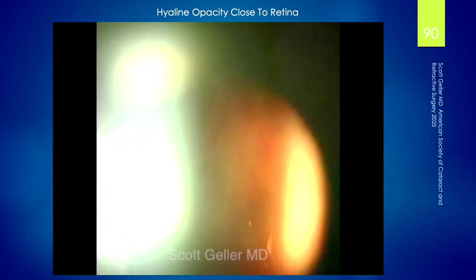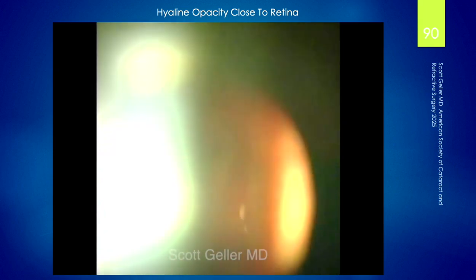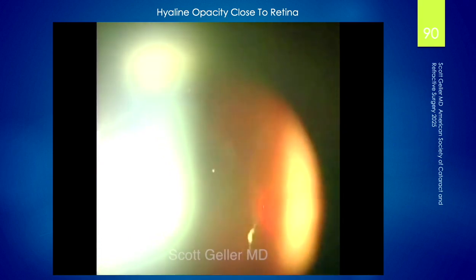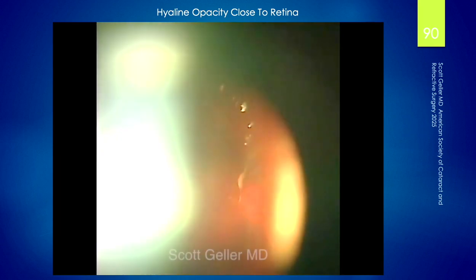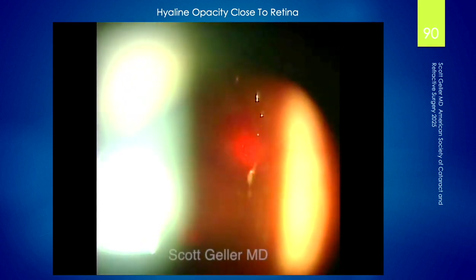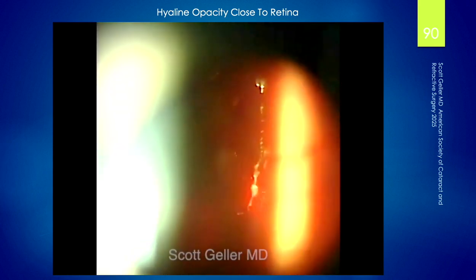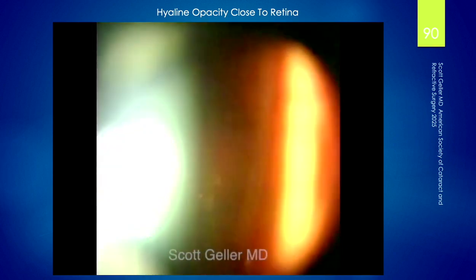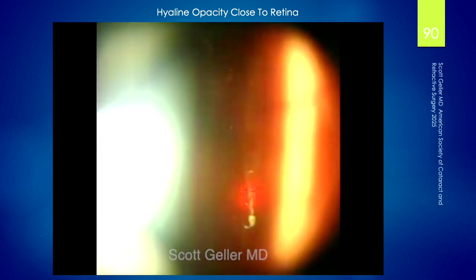Sometimes with an early PVD or an incomplete PVD, these things occur. Sometimes with a complete PVD, it occurs. So just be patient. Do like I said, use single shots. Maybe throw in a few pulses anterior to the opacity to see if you get a proper optical breakdown. And as I said in the didactic part of this lecture, you can work 3-4 millimeters from the retina, maybe less. I can't say what that is, but it's definitely less.